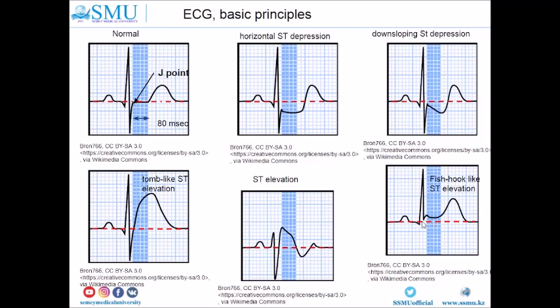Please pay attention to the shape of the ST segment in early repolarization. In this case, the ST segment is concave — like a fish hook. This is a benign pattern of ST elevation.